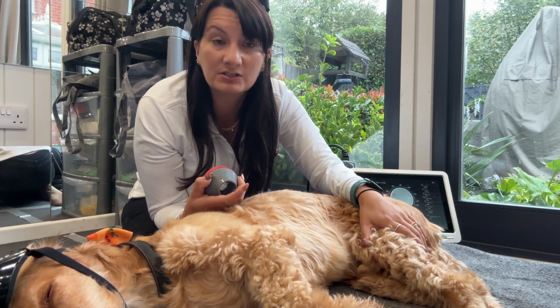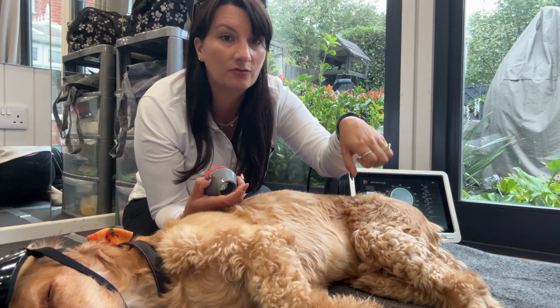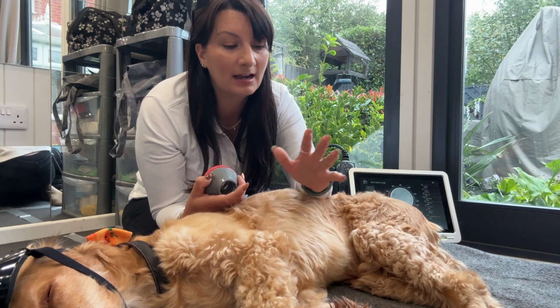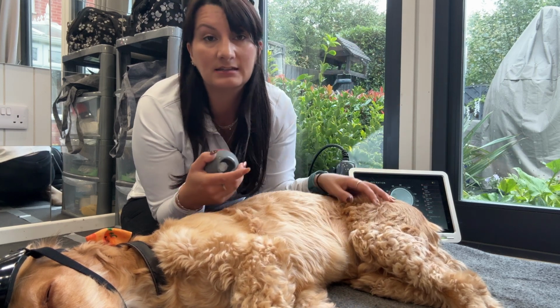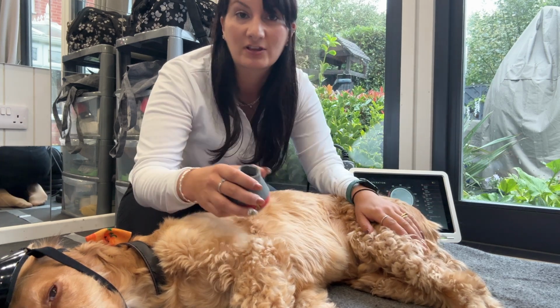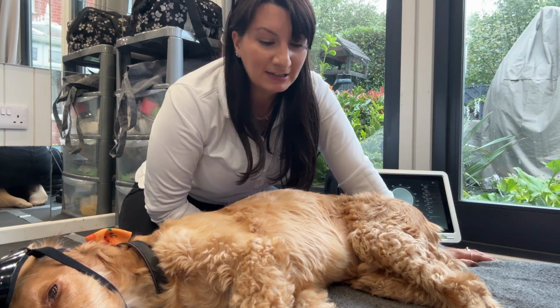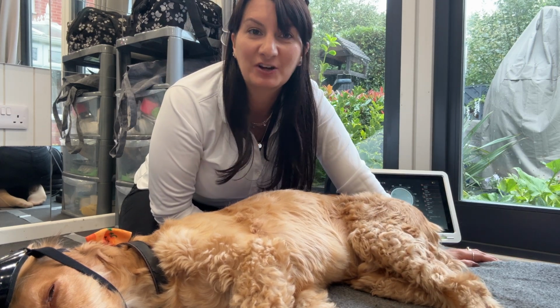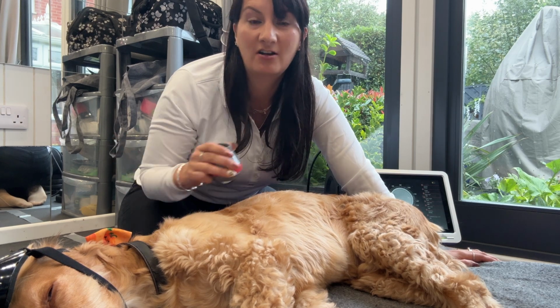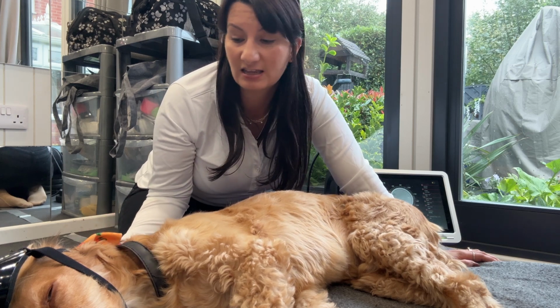Performing range of motion is another big one, because if we're going through range of motion, particularly joints like the elbows that are quite complex, it allows us to get into all those nooks and crannies that maybe we wouldn't get access to by lasering them without that range of movement. So there's lots to think about in optimizing treatment. It's not just a case of turning your laser on, punching in a number and spotting around, or just waving it around like a magic wand. There's a lot more to it that you need to think about.